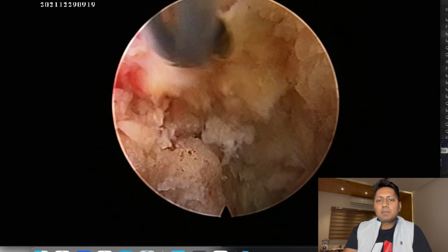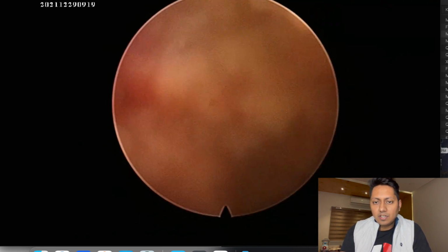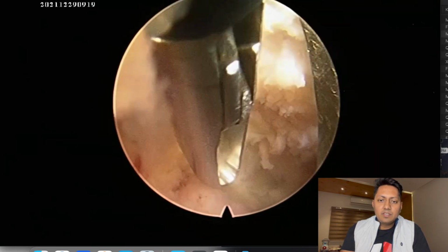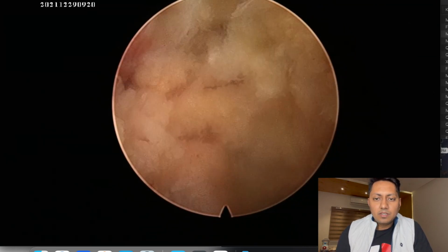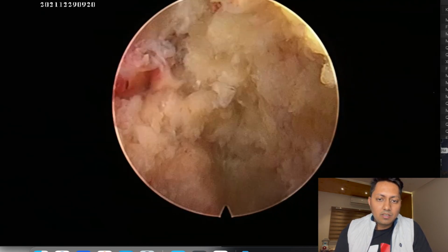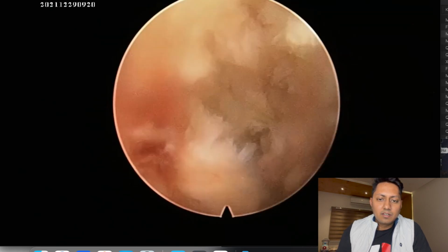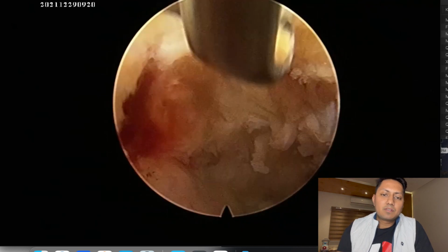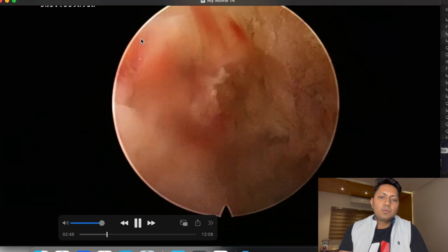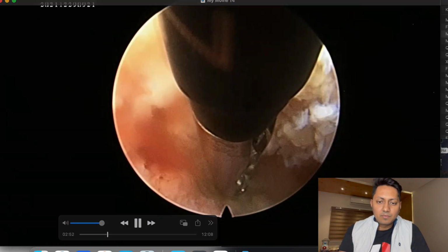Now I use a plasma cautery to achieve my hemostasis and shrink the soft tissues. Now these disc materials are not loose and these need to be cut always. In case of stenosis, there will be hard disc which needs to be cut by annular cutters and subsequently removed by graspers. As you can see, this neural structure has started to appear and it has started to move freely now.